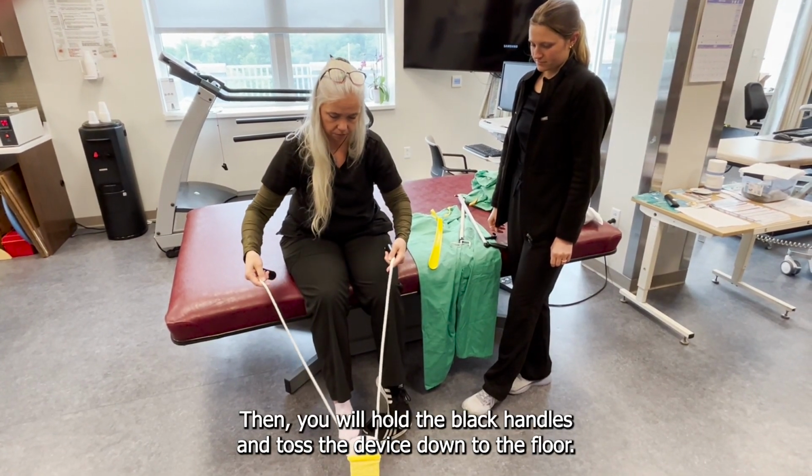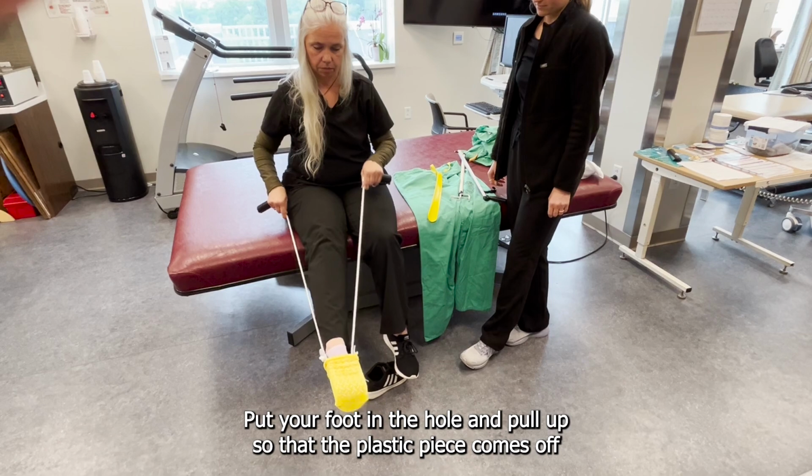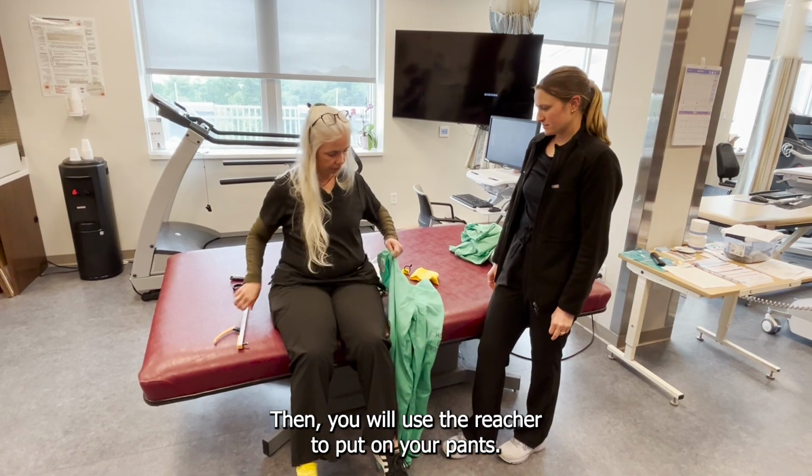Then you will hold the black handles and toss the device down to the floor. Put your foot in the hole and pull up so that the plastic piece comes off and the sock stays on. Then you will use the reacher to put on your pants.